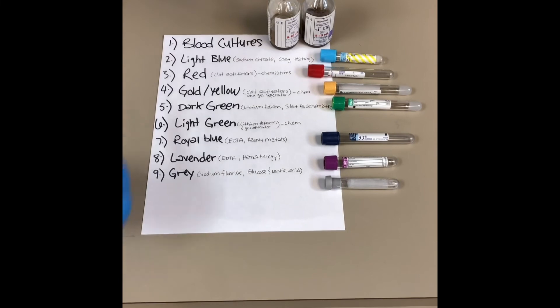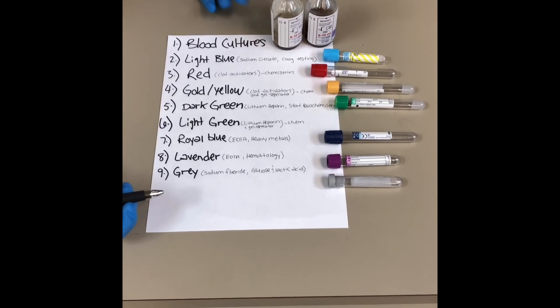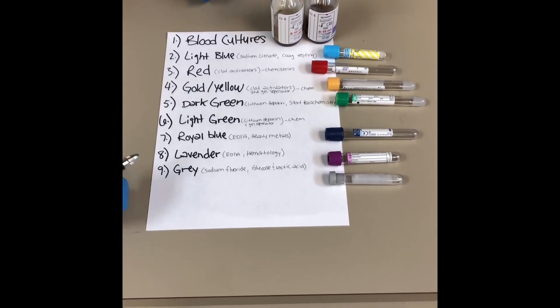It's really important to follow these tube orders so that all the testing and the analyzers don't get confused and you can produce the right results with the proper tube.